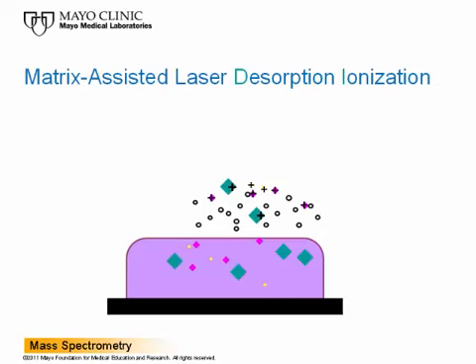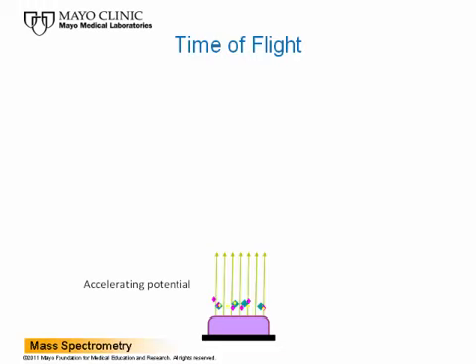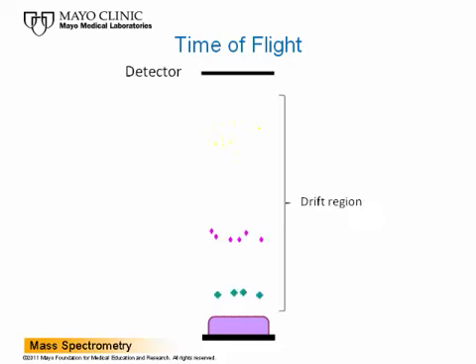This causes the sample to desorb and form singly charged ions, the desorption and ionization component of matrix-assisted laser desorption ionization. Next, the mass of the ions is analyzed. This is accomplished using a flight tube, the lighter ions traveling faster and therefore being detected earlier than the heavier ions. In the described method, particles are typically singly charged. The net result is generation of a mass spectrum in which the mass to charge is plotted against signal intensity.